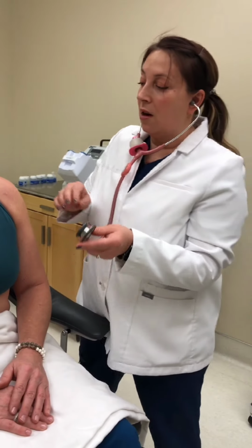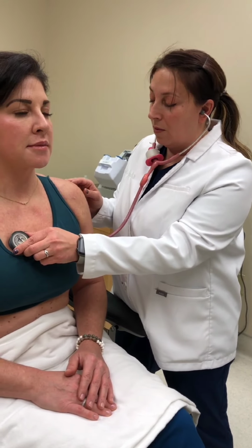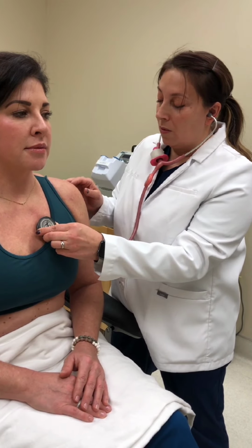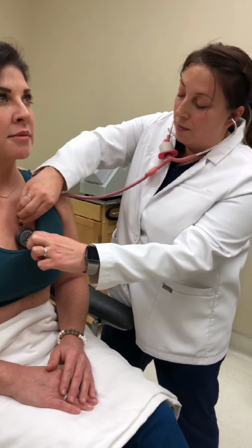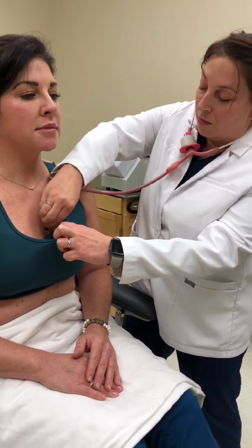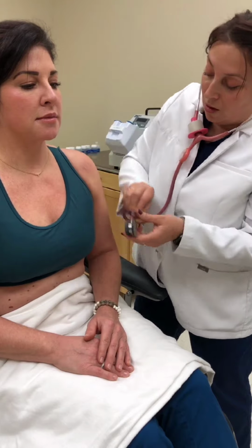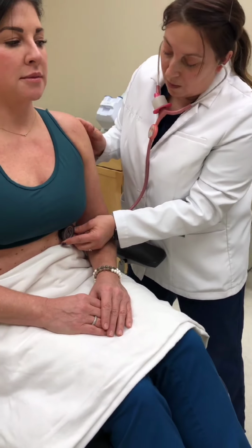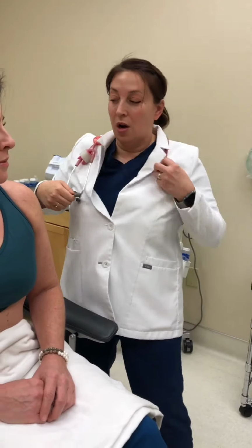Good, and stay right there. Listen for murmurs here. And Erb's point. Good, last time here. And no murmurs, no extra heart sounds, no S3, no S4, no rub.